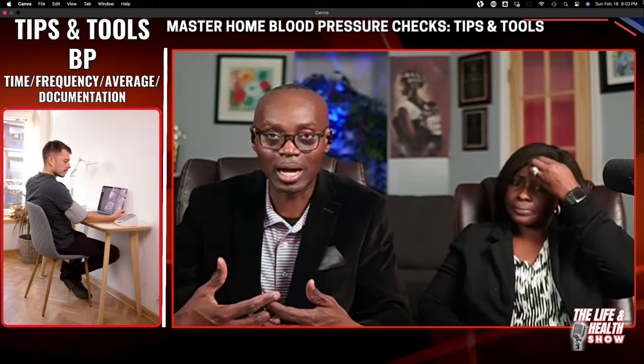We are not saying that you take 3 readings and add them up and divide by 3. No, you can tell. If you do 3 and 2 of them are like 142, 150, and the first one is like 162, you know that the 162 may be off. That's probably when you just came to sit down. So you take the 2 and say that you probably are around the 2. If you do 2 and 1 is higher, you probably need to do another one to confirm which one is actually the normal reading for you. That's why 3 is usually the best. But if you can even do 2 for us, praise God.